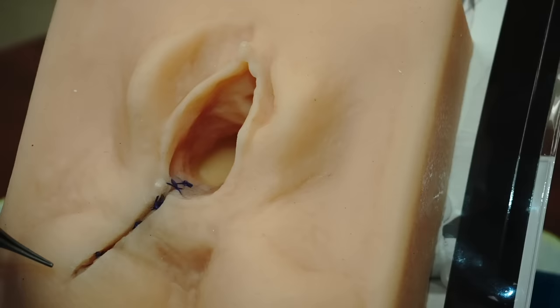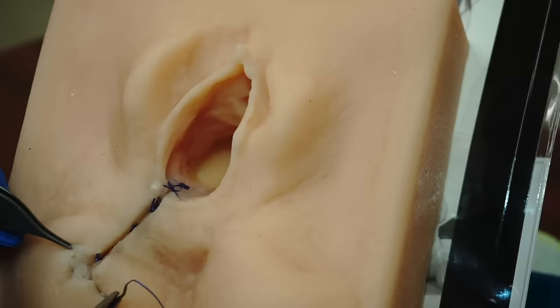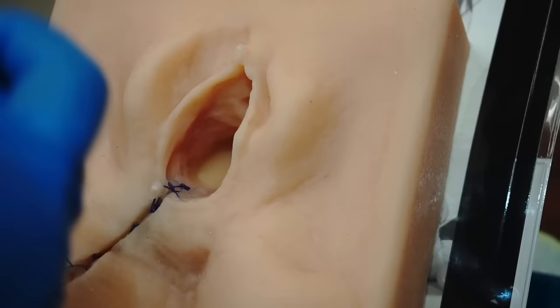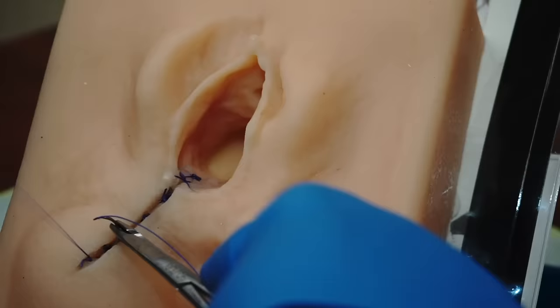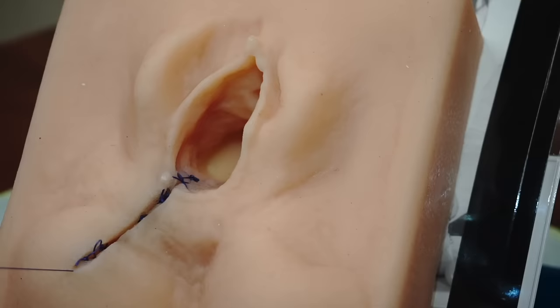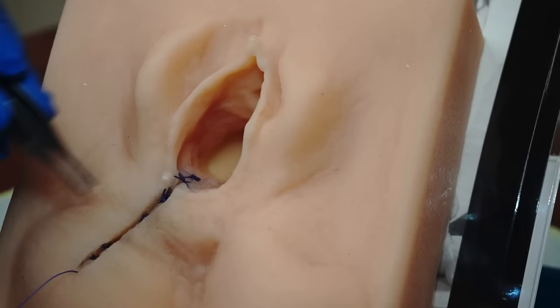So now we're ready to complete the final layer of suture that will be placed as a subcuticular stitch, anchored here at the apex of the episiotomy and working my way back up towards the hymenal ring. I'm going to place an anchoring stitch with my 2-0 Vicryl to bury the knot and start the subcuticular in an upwards direction towards the hymenal ring. The suture will disappear into the perineum and into the perineal body, and now the knot has been buried and we are ready to run our subcuticular stitch upward towards the hymenal ring.